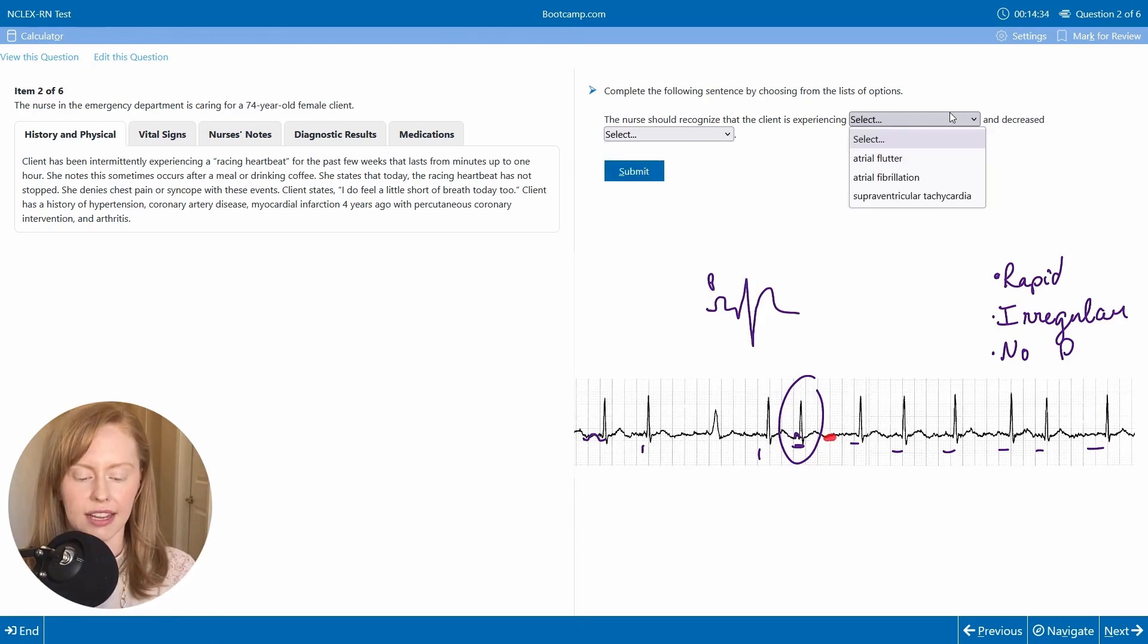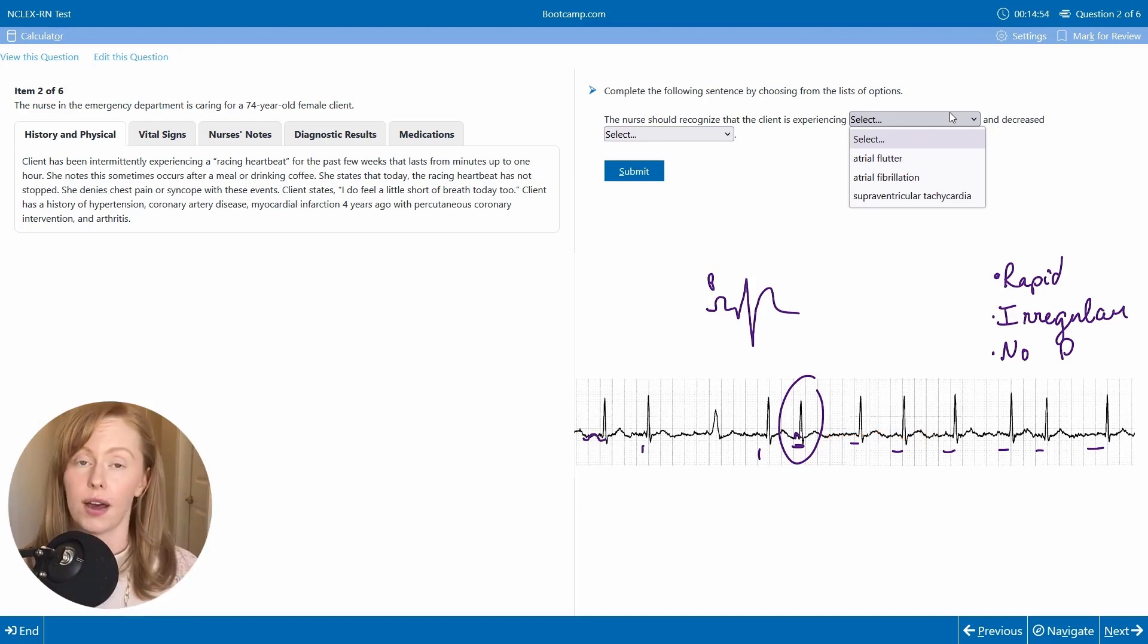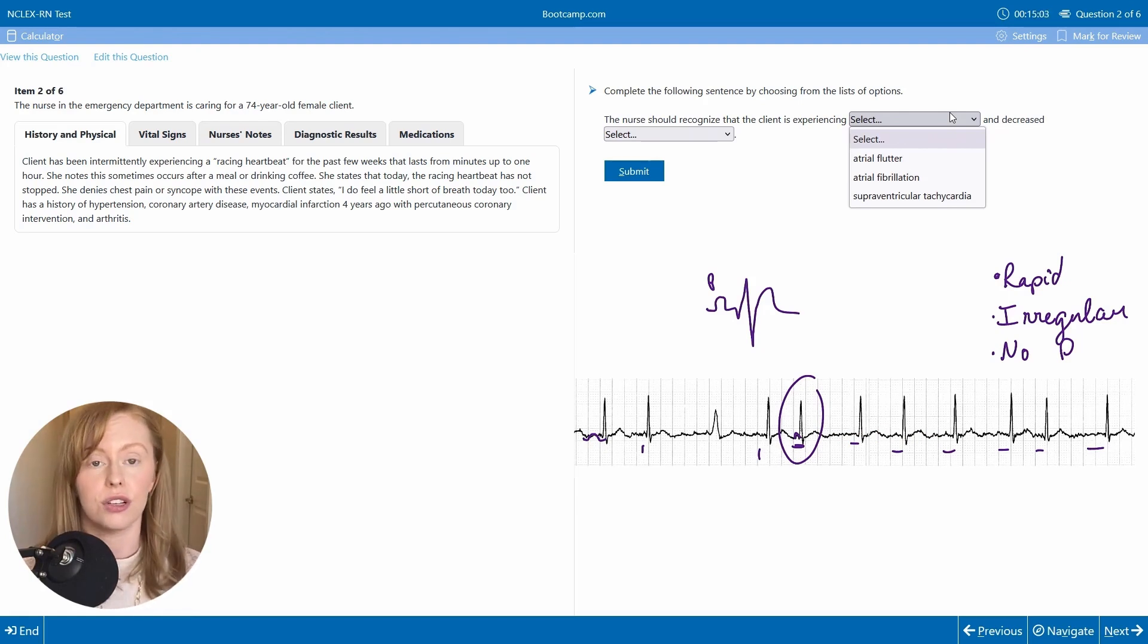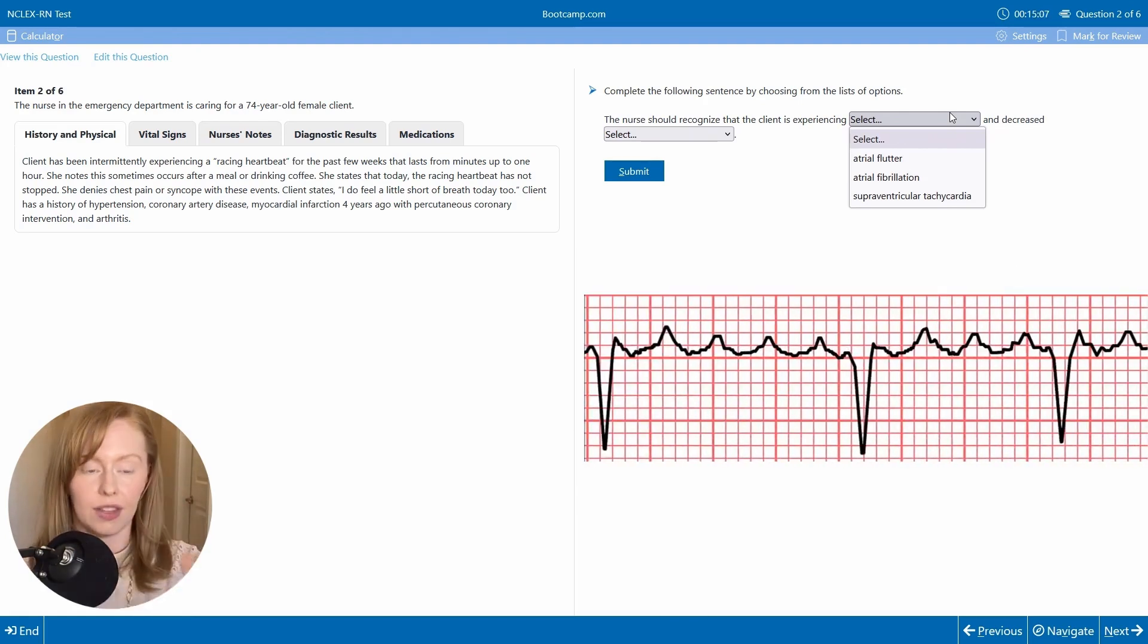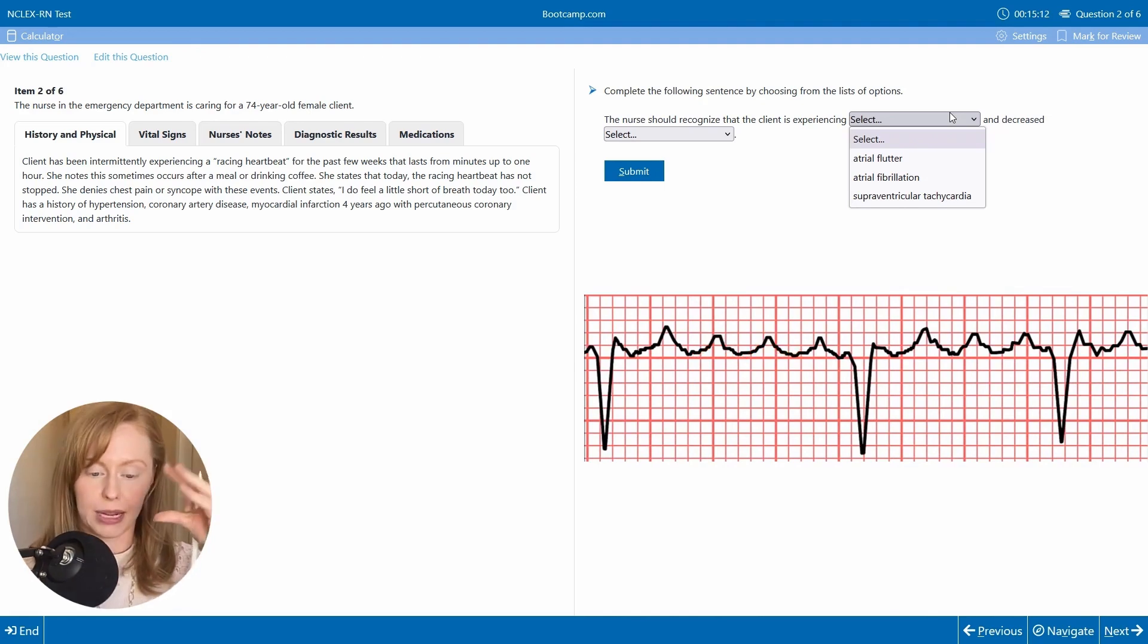We have just these kind of fine fibrillatory waves, these kind of quivering waves. So that would mean either an atrial fibrillation or you might have atrial flutter in which you have these sawtooth waves that are flapping.